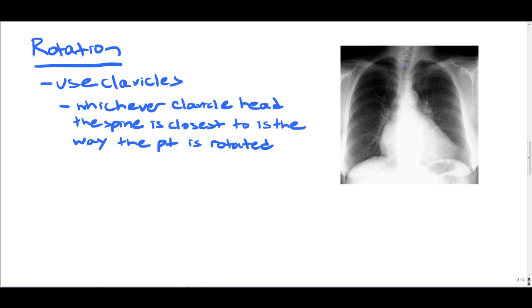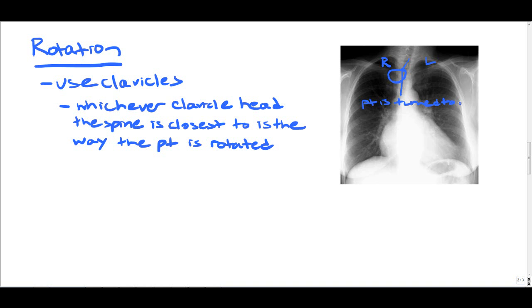So here we have an x-ray that is rotated. If you look at where the thoracic spine is and identify the clavicle heads, the one on our left is actually the patient's right clavicle head. And you'll notice that the thoracic spine is closest to the right clavicle head. So the patient is rotated or turned to his or her right side.